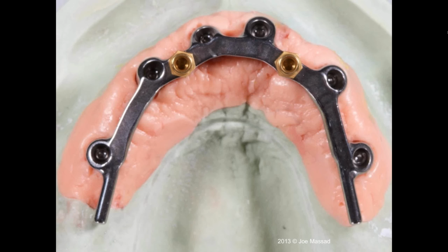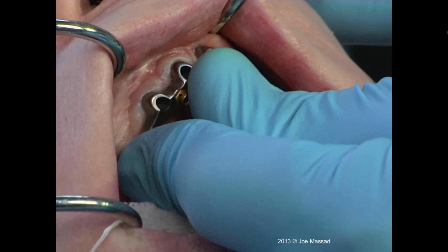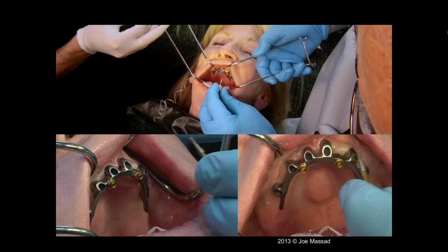So now, will this fit passively? You see a little blanching of the tissue. Take a little laser, just open that up. But this was by design. We didn't want there to be anything in there that would actually create an opening. So I would rather blanch slightly and then just clean that up, and then do the one screw test again and radiograph. If this fits well, then put in the rest of the screws. So this is what we're doing here. This is one piece, with the abutment and the bar all in one piece.